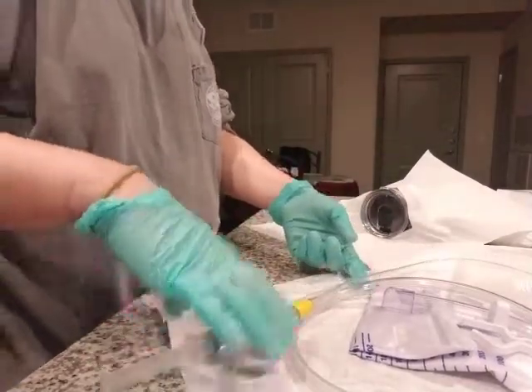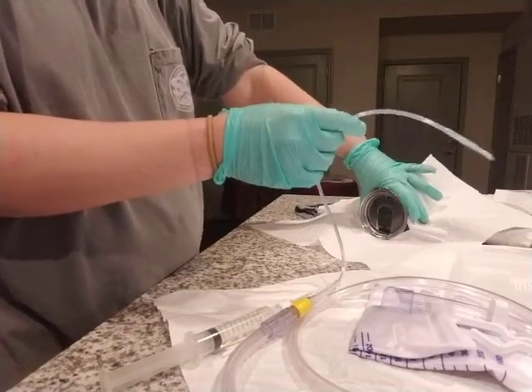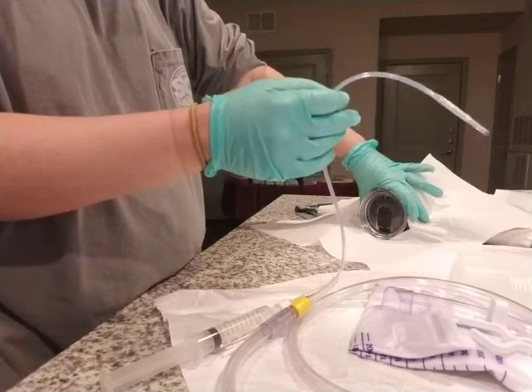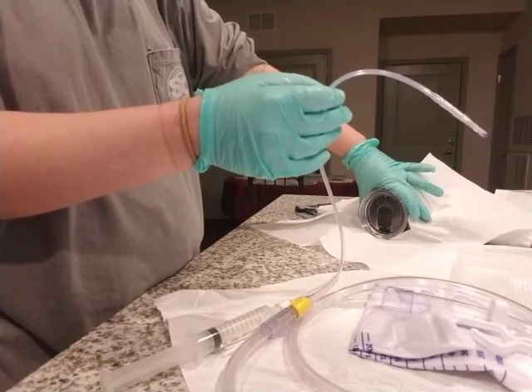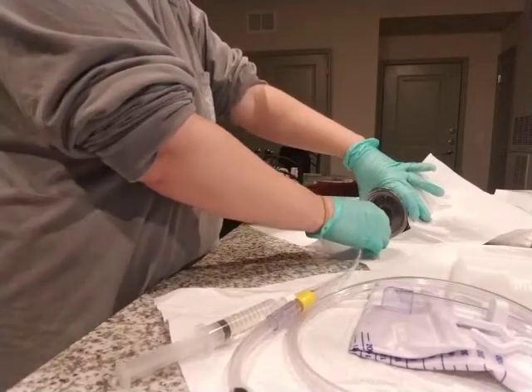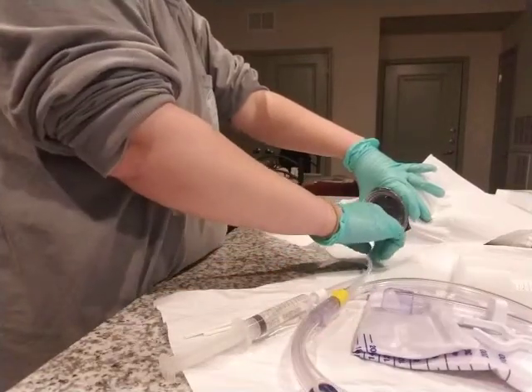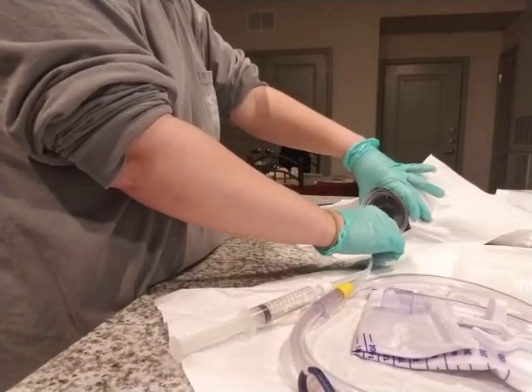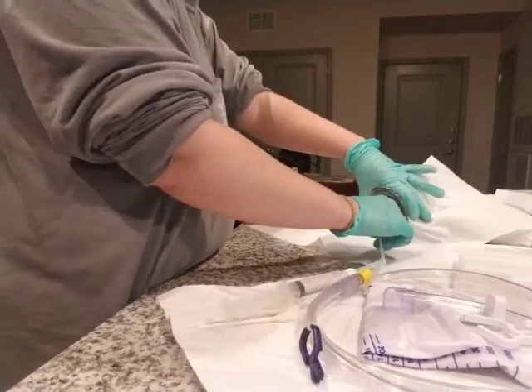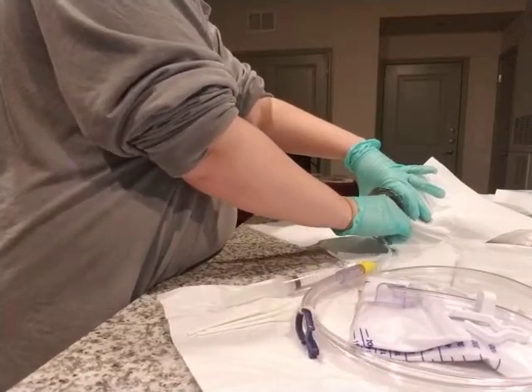I'm going to grab the shaft with my non-dominant hand, and I'm going to alert the patient that I'm going to be inserting, and then I'm going to insert 7 to 9 inches, and I should tell them also during this to breathe for comfort if they need to. I'm going to keep going until I have met resistance, which I have met resistance.